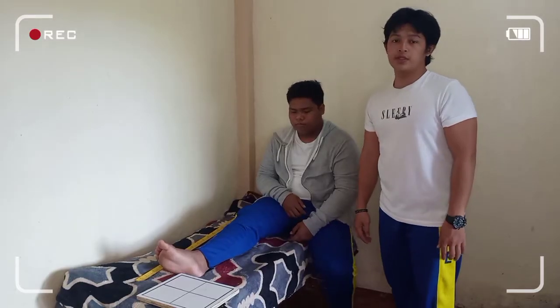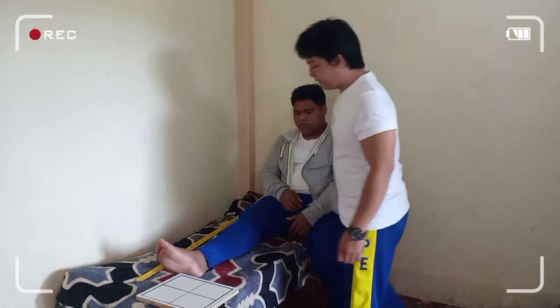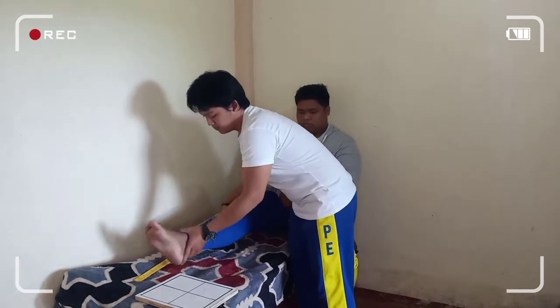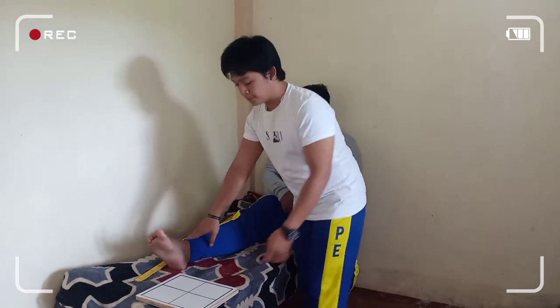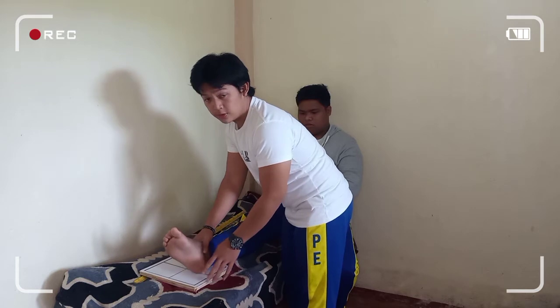The next projection of the foot is the lateral projection, mediolateral. Have the patient lie on the radiographic table and elevate the knee to place the patella perpendicular to the horizontal plane. Center the image receptor to the midfoot and rotate the foot on the affected side.